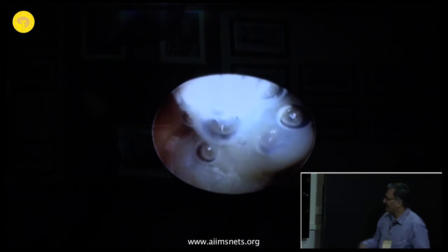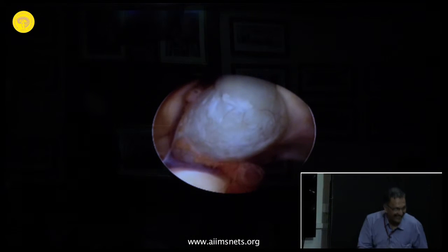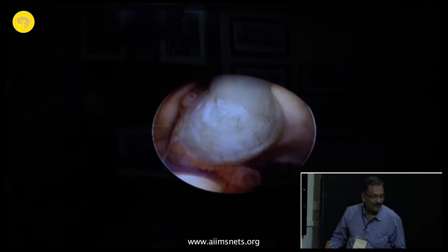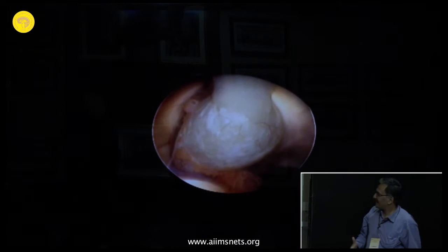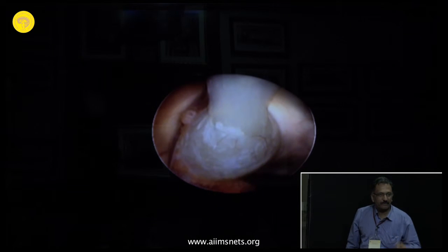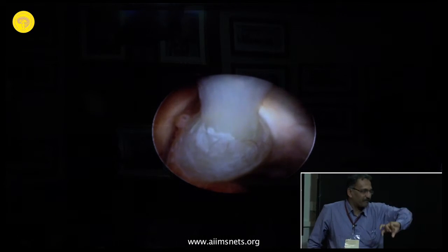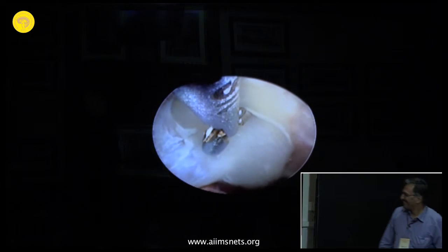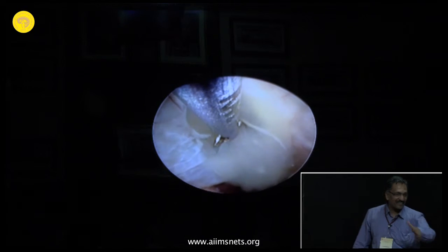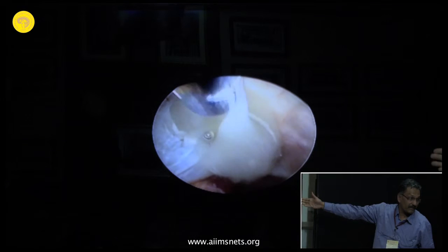And your suction tubing is not sucking this. You don't know what to do with this. It's not flowing out, and your suction tubing is not sucking it. So what do you do? You take a biopsy forceps. Now your biopsy forceps has a 1 millimeter opening. You don't have the patience to keep doing that all the time. How much can you do? Even a patient man like me doesn't have the patience to go on with the biopsy forceps. How much can you take out with the biopsy forceps?